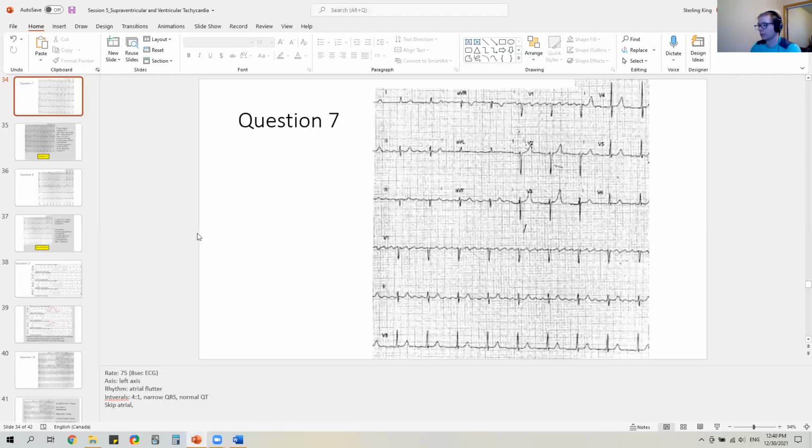All right, let's just get back to this. So checking ventricular hypertrophy. Doesn't look like there's any left and doesn't look like there's any right. So no hypertrophy. Where are the intervals? Bundle branch, no.